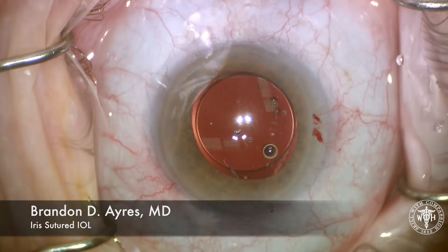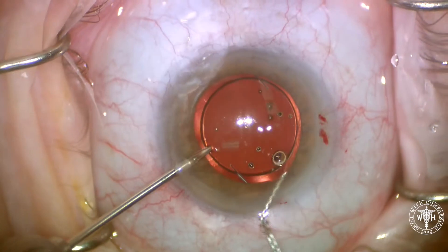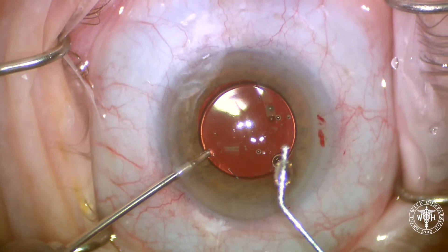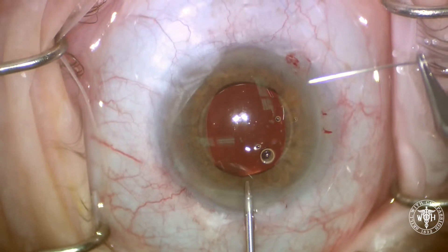This is going to be an iris sutured IOL, a relatively simple case. You can see a little area of loss of integrity of the anterior capsule allowing this lens to sunset.